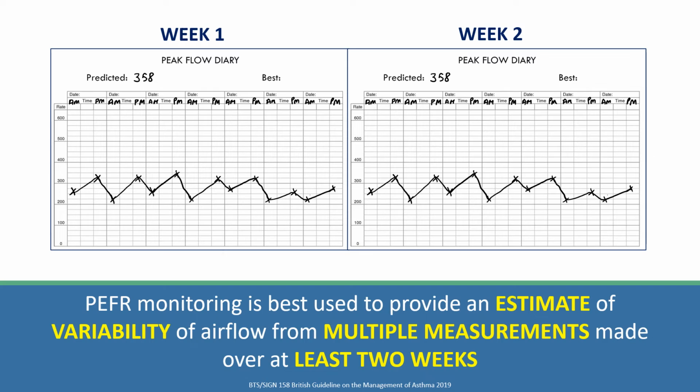However, sometimes you can miss uncontrolled patients because it doesn't correlate very well with lung function. Well, if you think about it, if you're going to get your patient to do one of these diaries, they're doing them at home anyway. If that patient can't get in, or for cross-infection reasons you don't want them to come in, there's nothing stopping you being sent images of this. Our job though is to know how to properly interpret it, and that's what I'm going to show you how to do now.